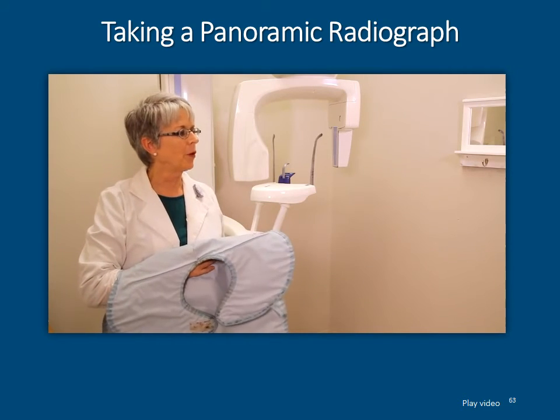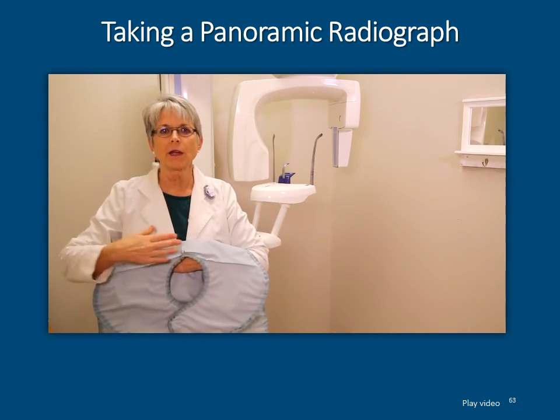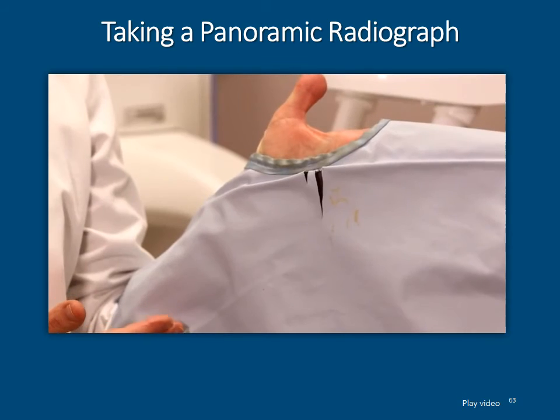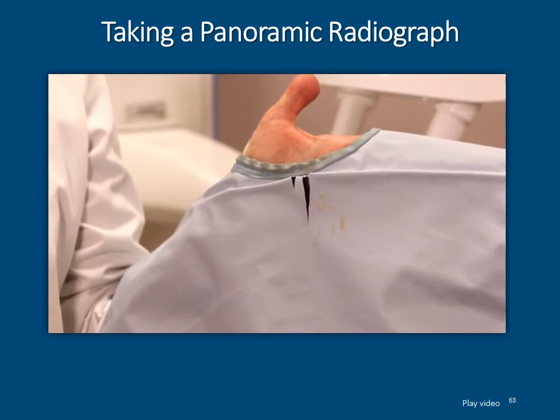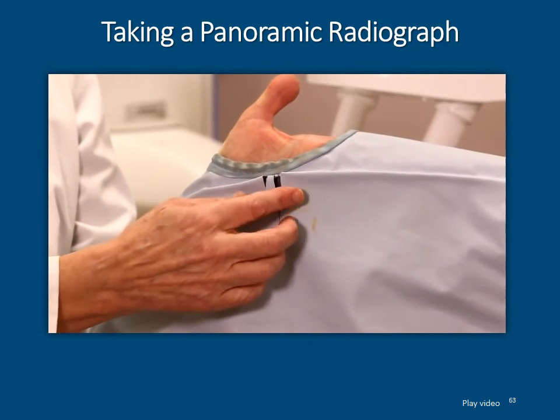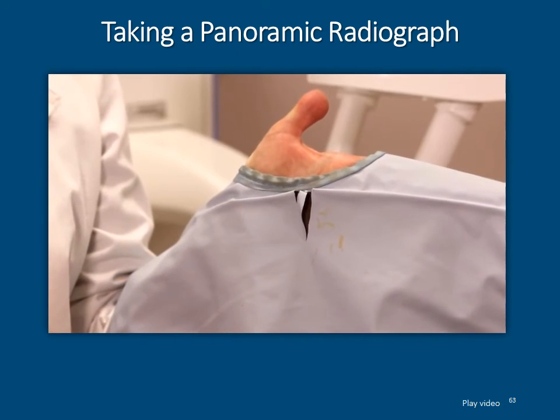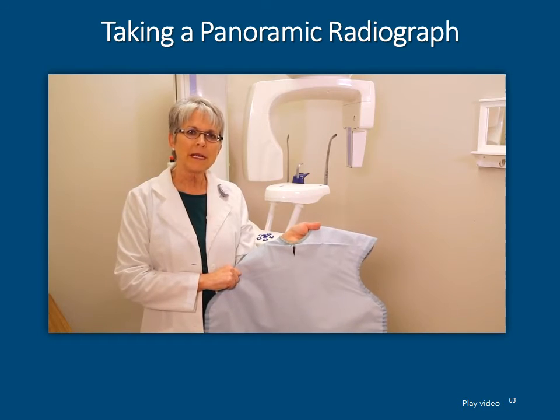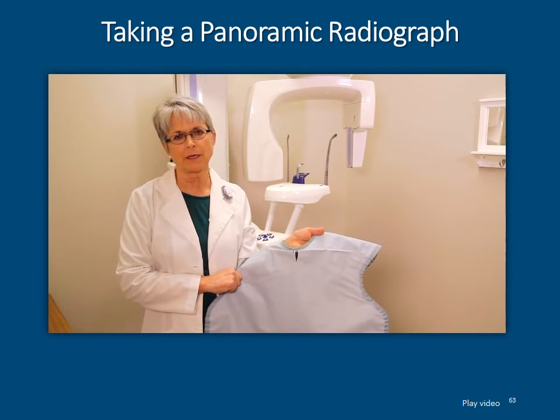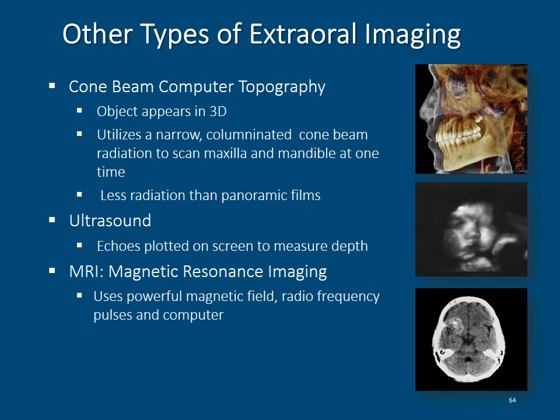In wrapping up, it's important to use the correct apron, but also it's important to check your aprons on a monthly basis to make sure that your aprons aren't cracked or have any pinholes in it. What happens is that when you have a crack or a tear, the lead is being exposed to the patient, and you do want to replace the apron so that your patients can be safe. You can eliminate these cracks by hanging up the aprons properly rather than folding them in half and putting them on a chair. There are other various types of extraoral imaging.